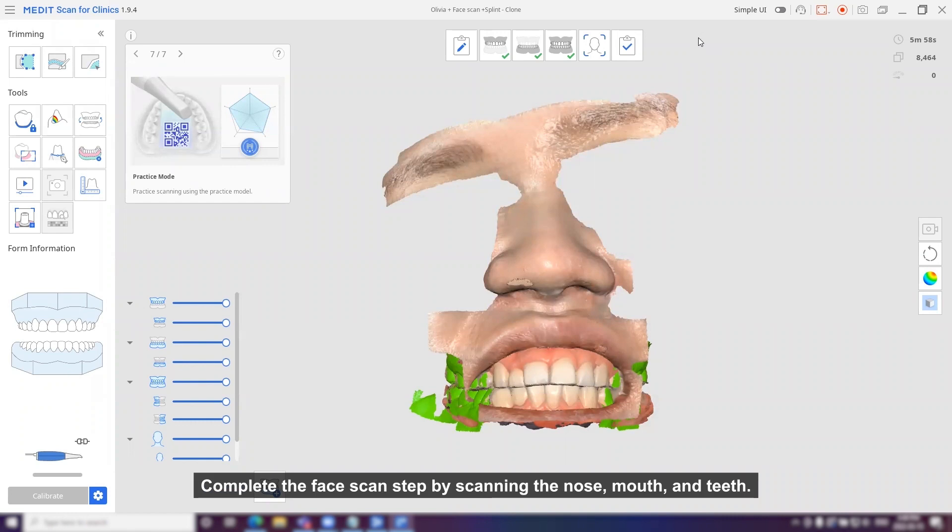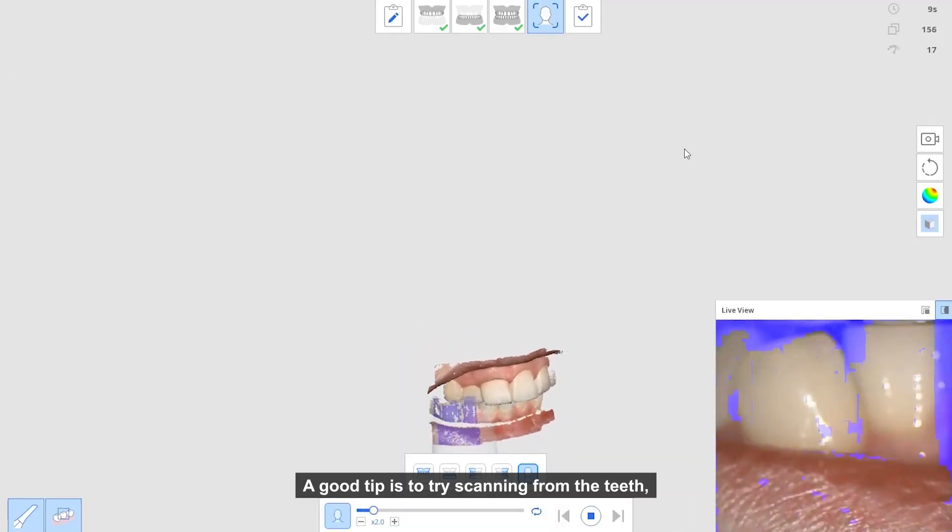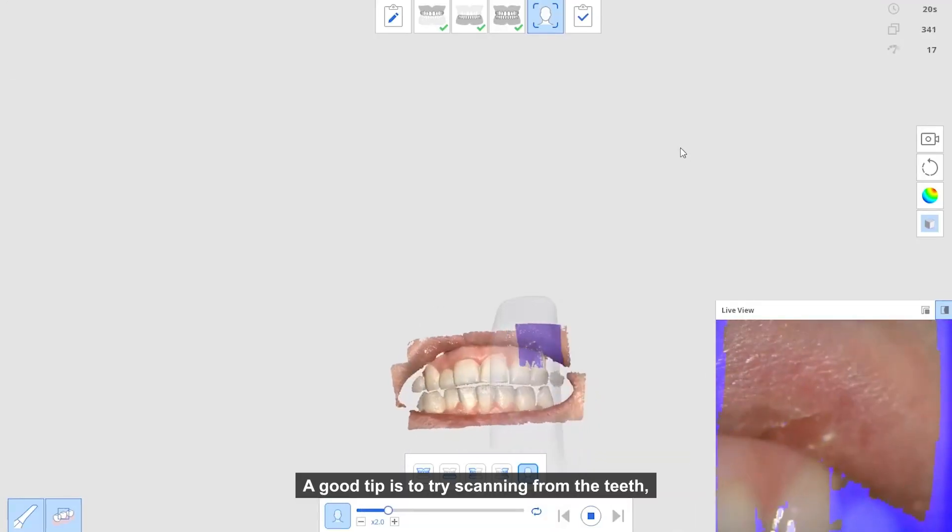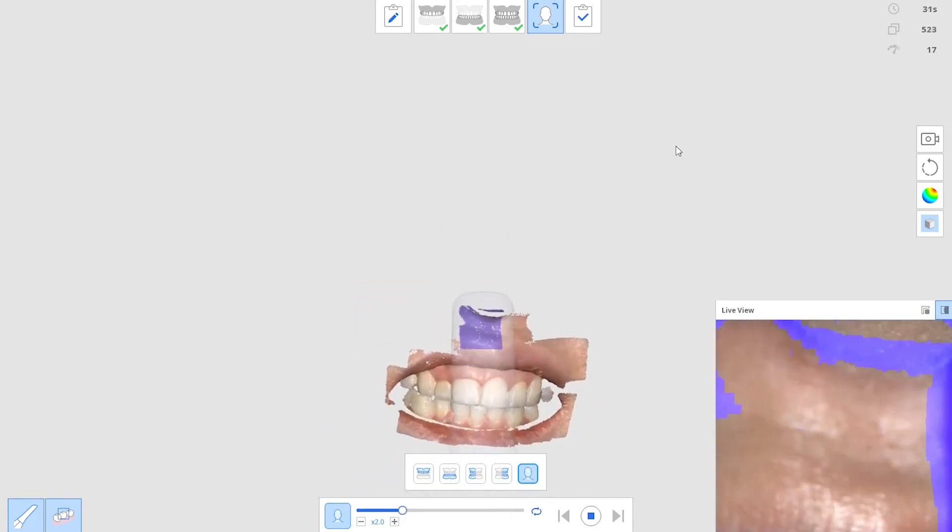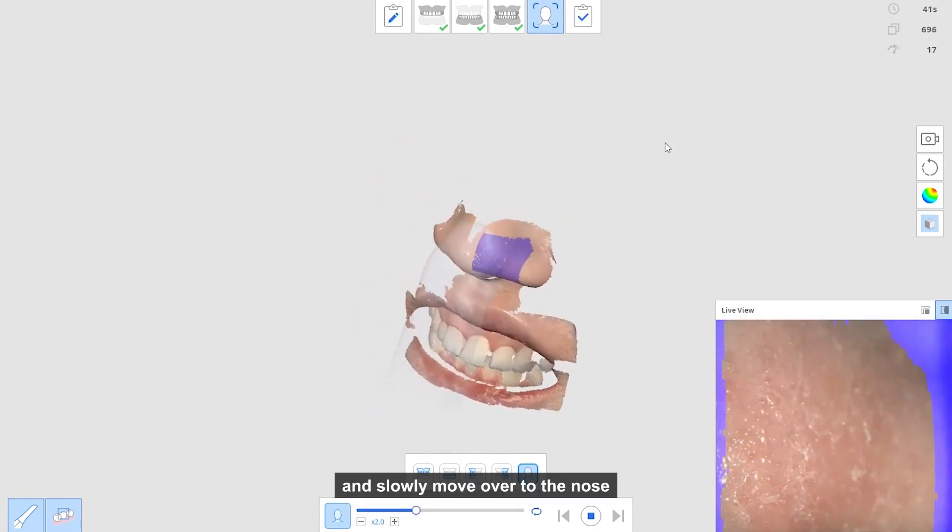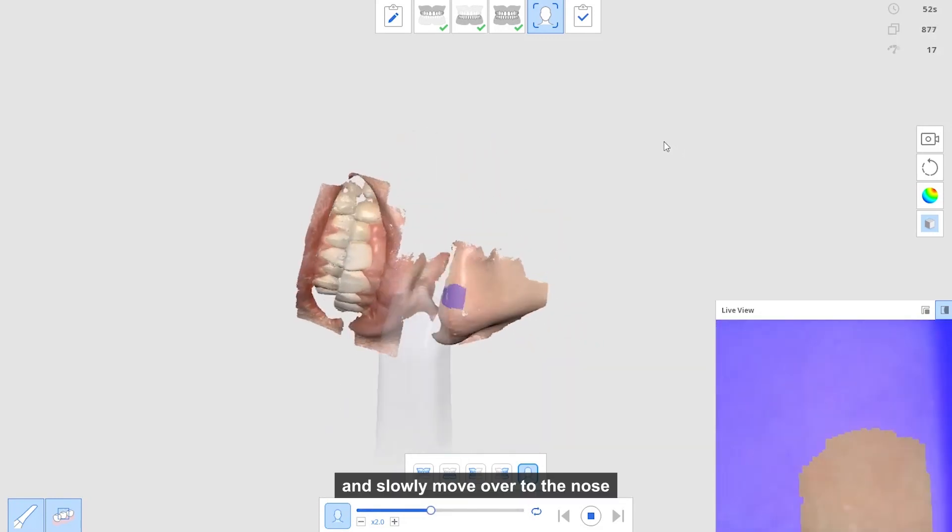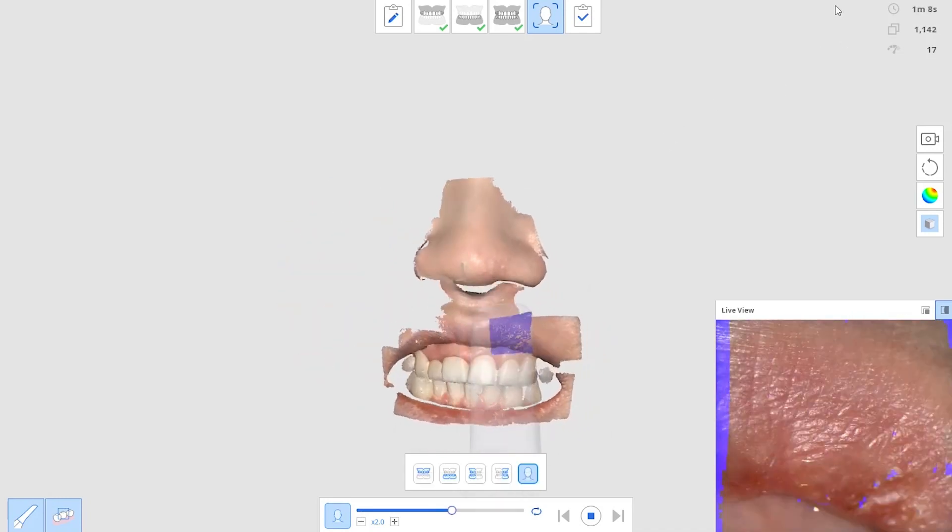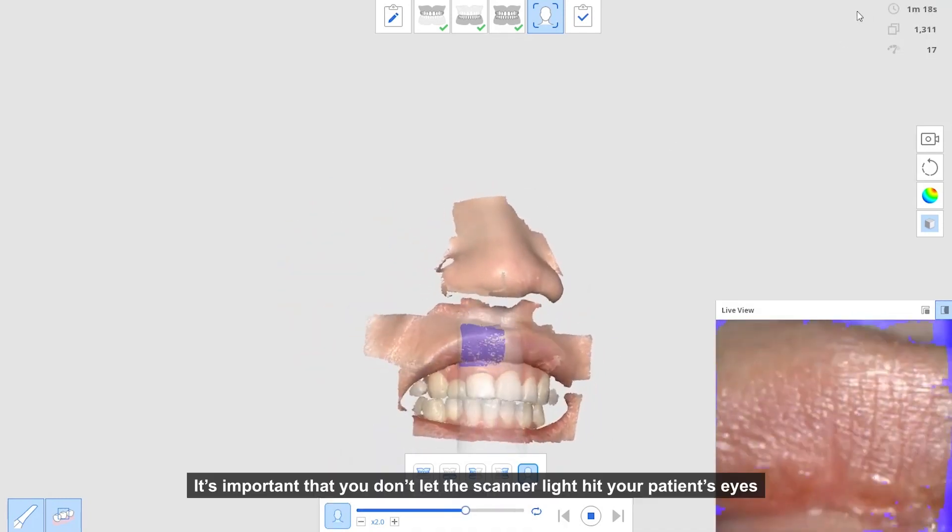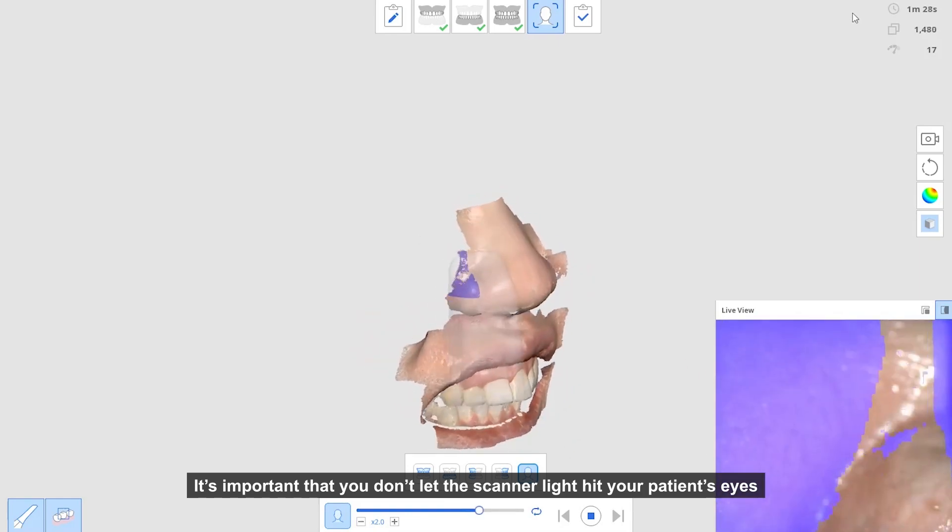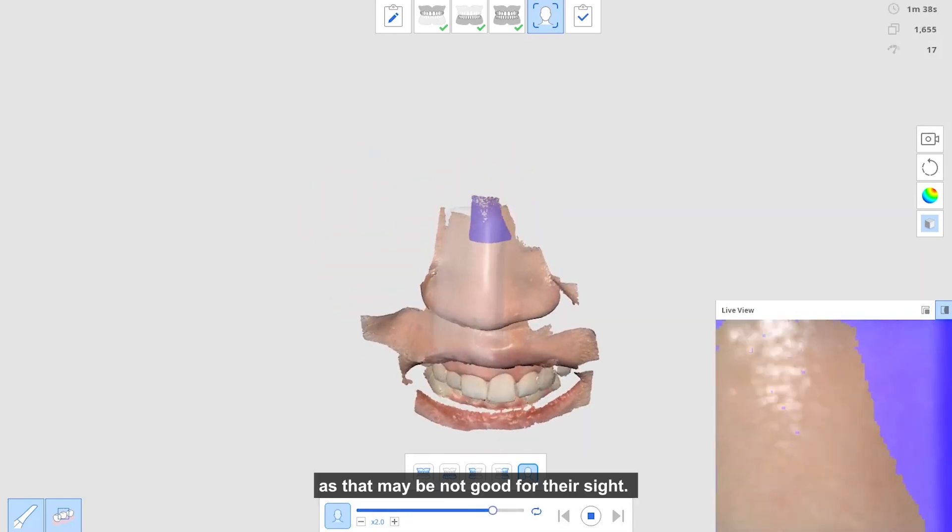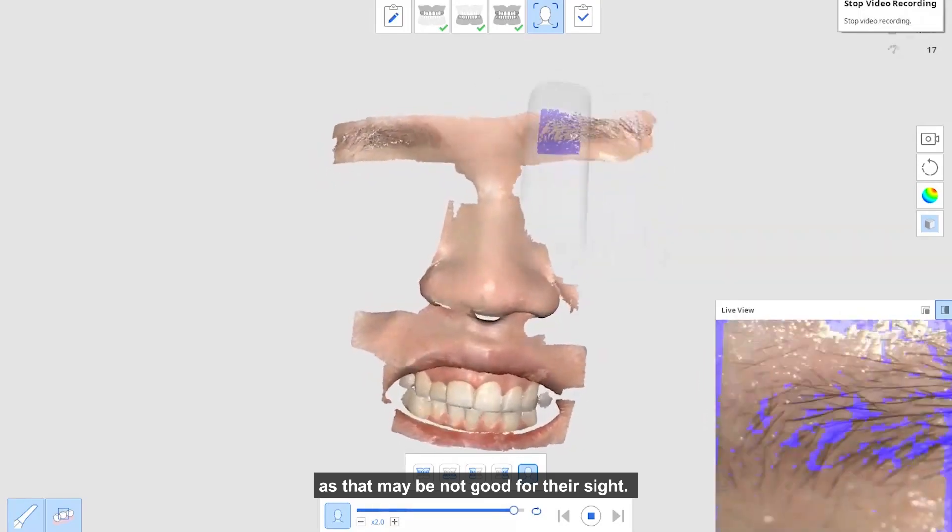complete the face scan step by scanning the nose, mouth and teeth. A good tip is to try scanning from the teeth and slowly move over to the nose and eyebrows. It's important that you don't let the scanner lights hit your patient's eyes as that may not be good for their sight.